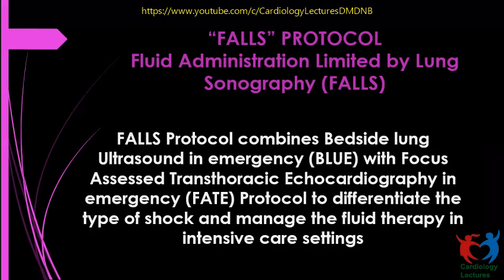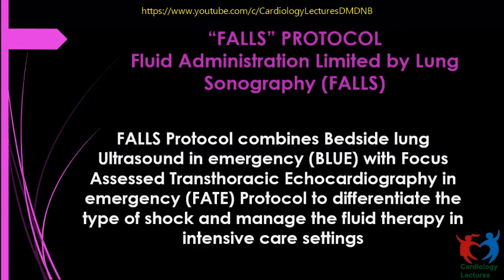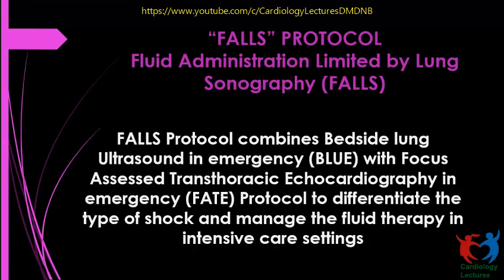Coming to the FALLS protocol. FALLS protocol is fluid administration limited by lung sonography. The FALLS protocol combines bedside lung ultrasound in emergency with focus assessed transthoracic echo in emergency, called the FATE protocol, to differentiate between different types of shock and manage fluid therapy in intensive cases. Just before going to the FALLS protocol, you should know a little about the FATE protocol, because it is a part of the FALLS protocol.